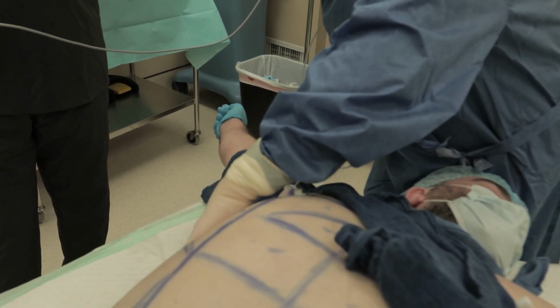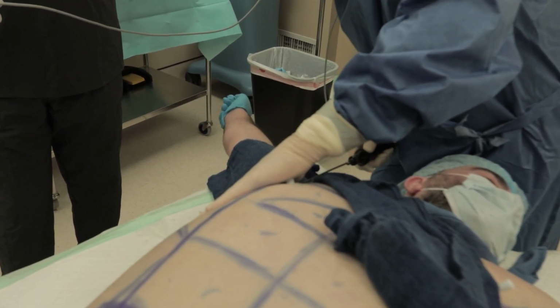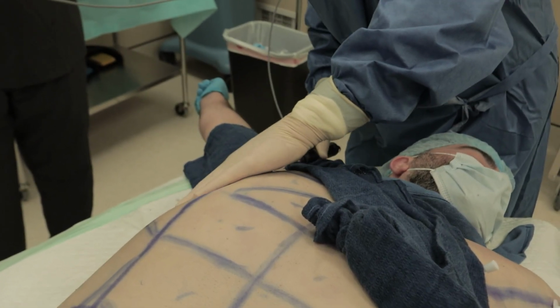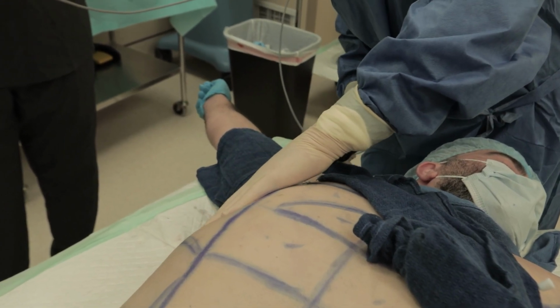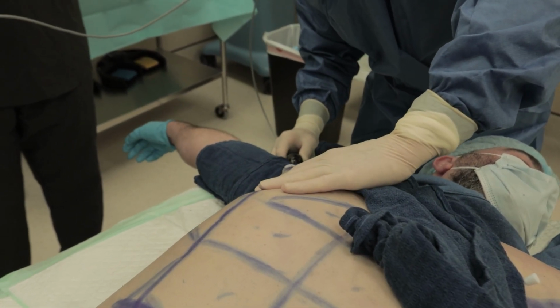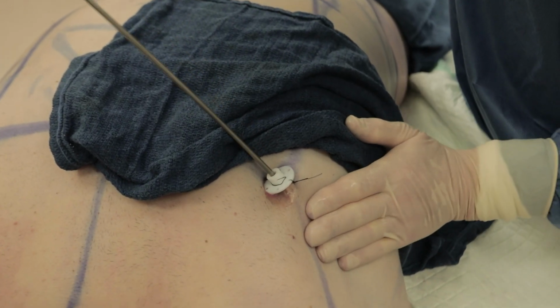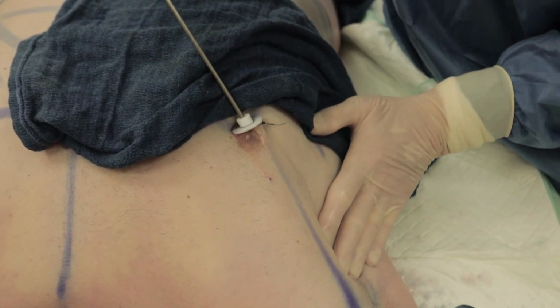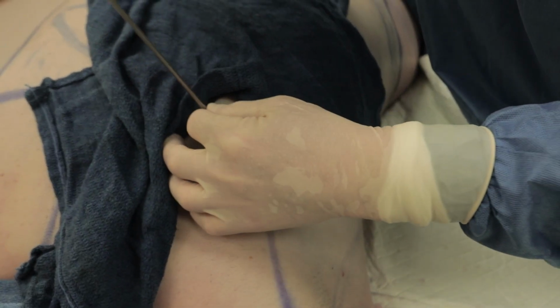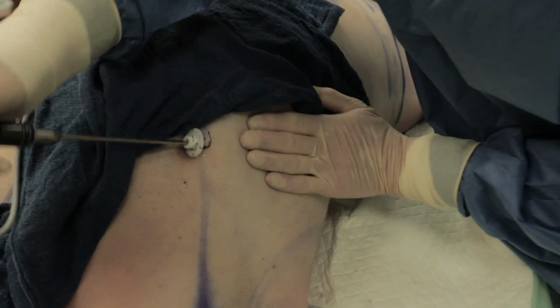We're on 70 Vaser. Perfect. So this is a 2-ring. I'm on 70 Vaser, and it's the 2-ring long, so I can really get down and hit everything through my stealth incisions. Really kind of work this nicely. He wants me to get this, which is very important. So get into the armpit here, down to the lats. Last couple of seconds. 1 minute to 3. Perfect.